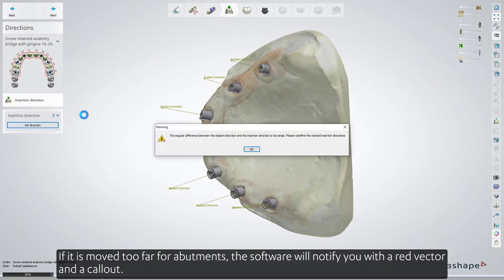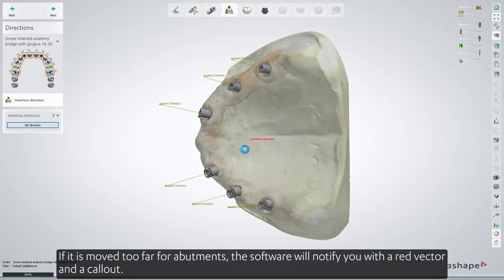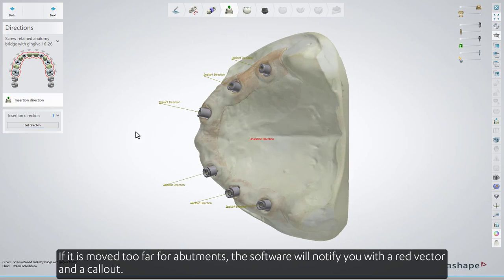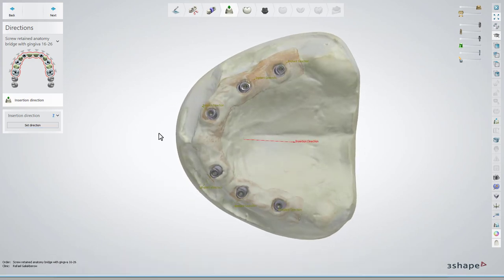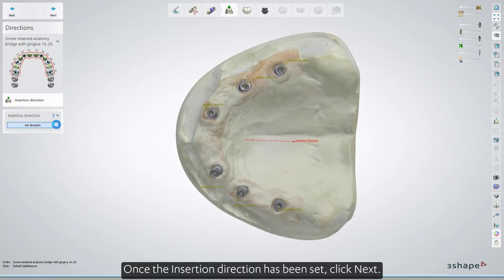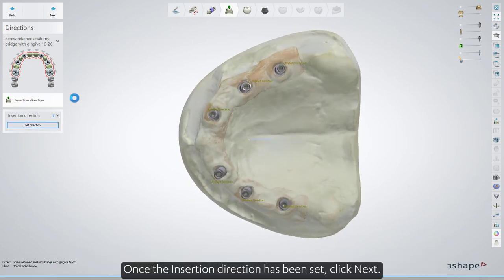If it is moved too far for abutments, the software will notify you with a red vector and a callout. Once the insertion direction has been set, click Next.